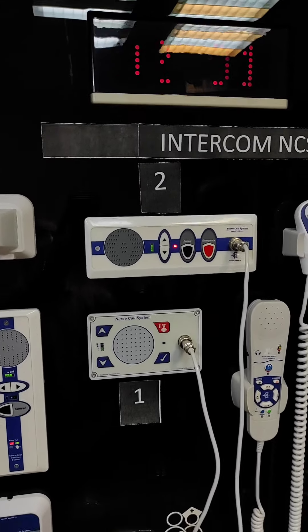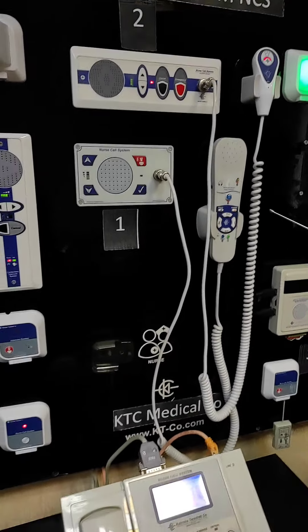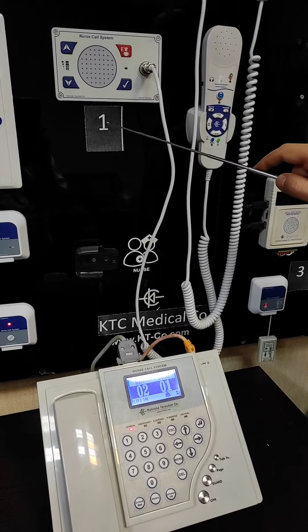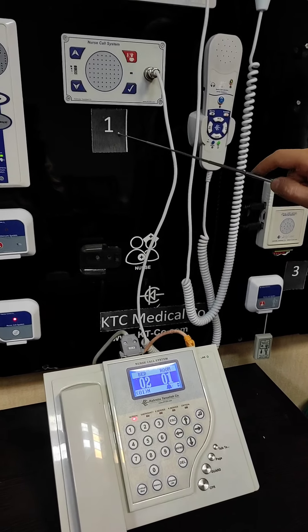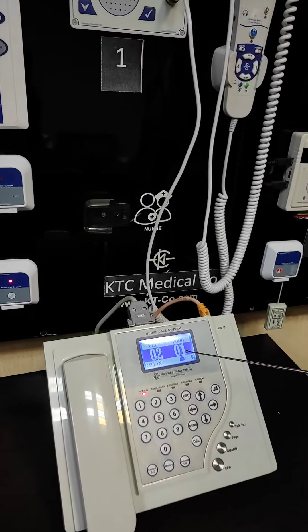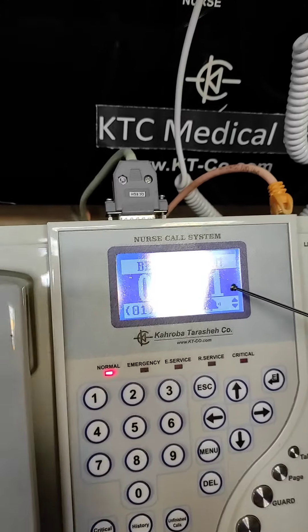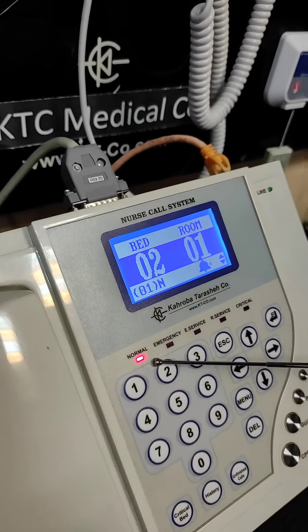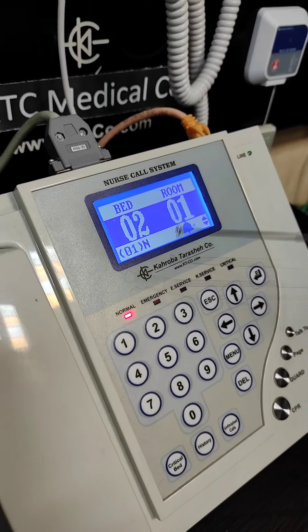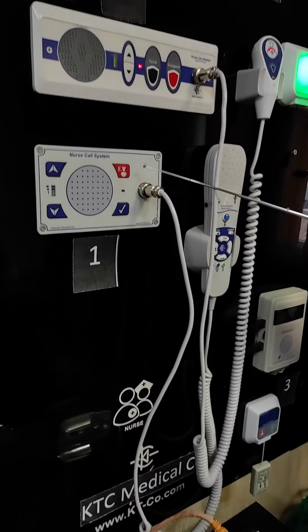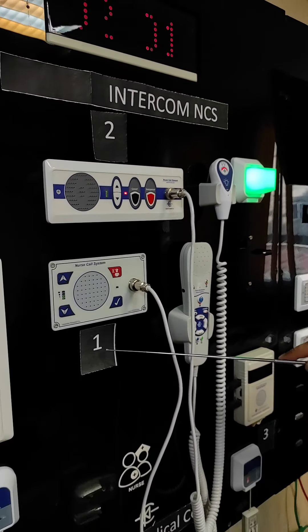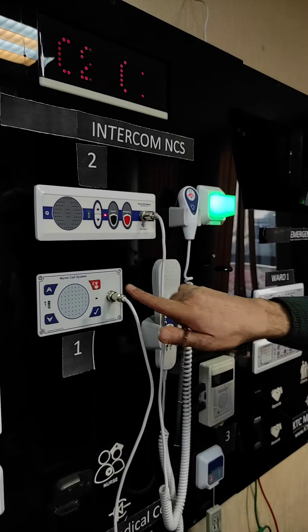We assume that at the same time, the patient on bed number one initiates an emergency call. On the staff console, before we initiate the emergency call, we have room number one, bed number two with a normal call showing. Now I press the emergency call button on bed number one, and we see what happens.